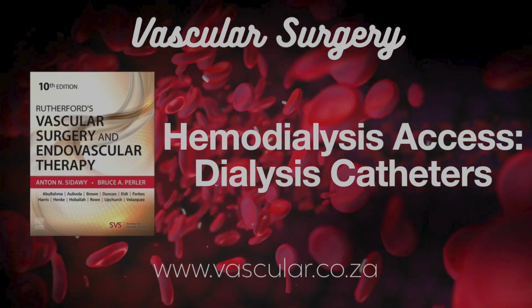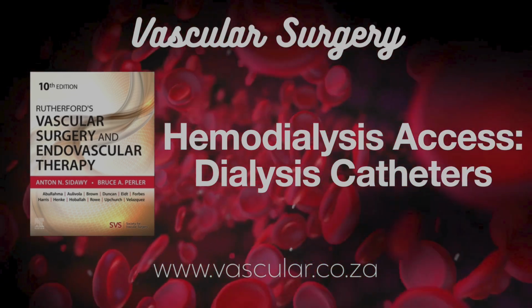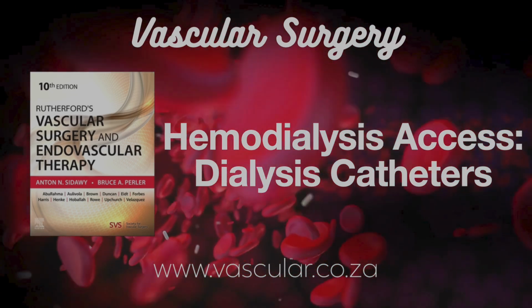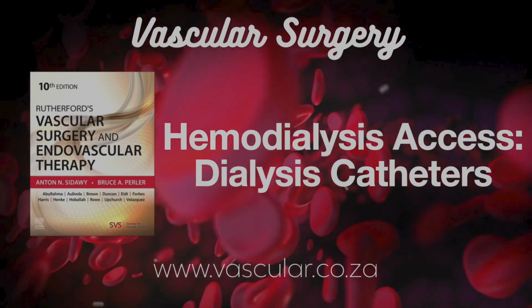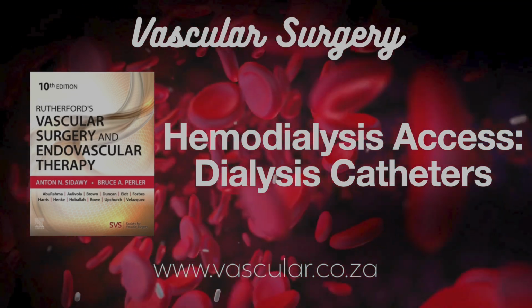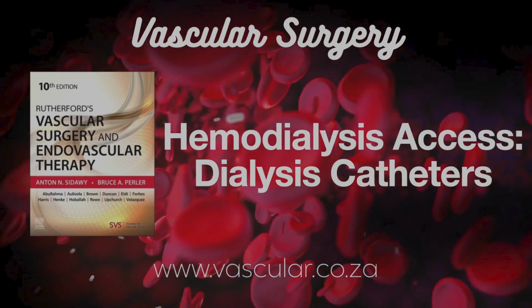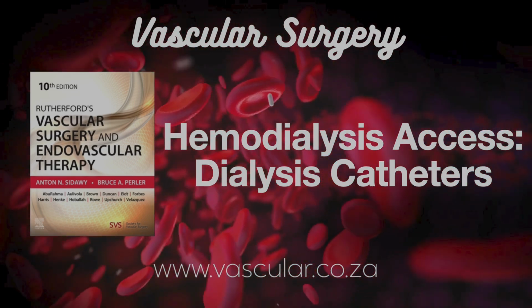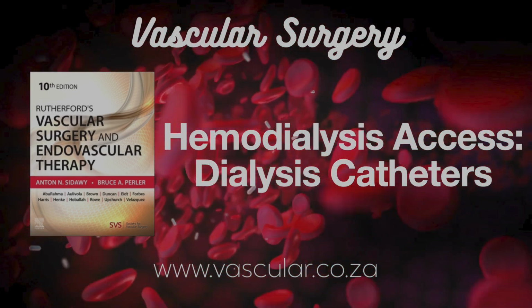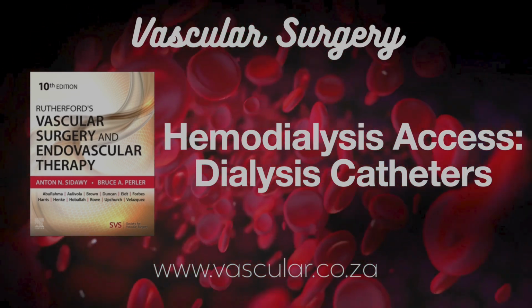Today we're getting into something really vital in kidney care, tunneled hemodialysis catheters, TDCs for short. That's right. These are lifelines, really, for patients with end-stage renal disease who need dialysis, often while they're waiting for a permanent access, like a fistula or graft. Or sometimes if that permanent access just isn't possible for them. And the numbers are quite striking. Something like over 80% of patients actually start hemodialysis with a catheter.